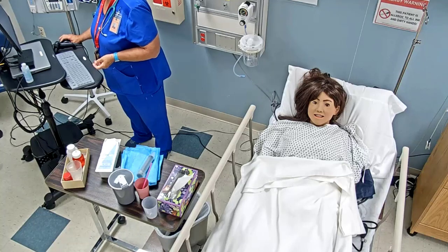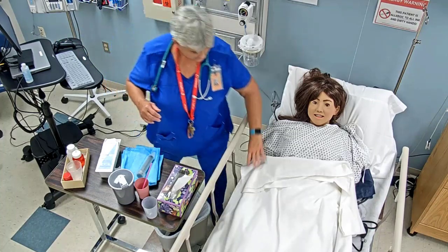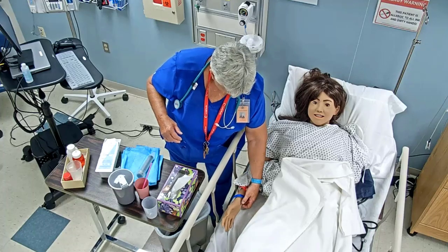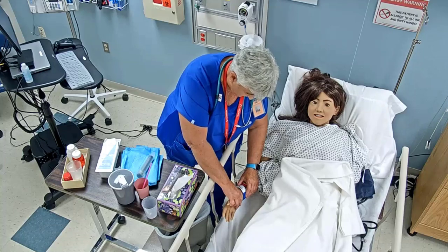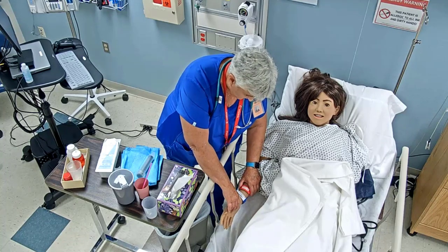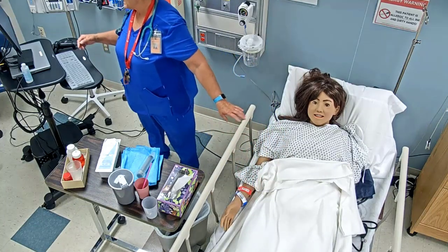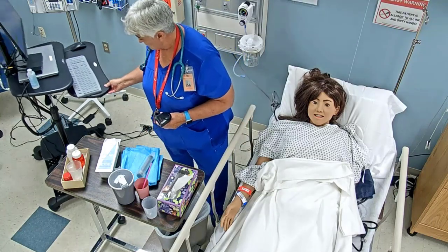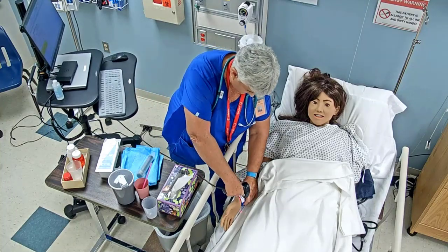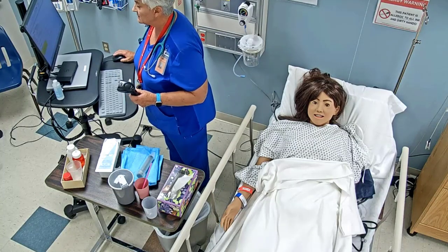So let me get all my things pulled up here. I told you who I was, and can you tell me what your name and date of birth is? Okay. Anna Taylor, date of birth 4/24/1991. Now, are you allergic to any kind of medications? No, not any medications, and that's what I have here. And so I'm going to go ahead and scan your armband. Okay, and we've got your armband scanned, okay?